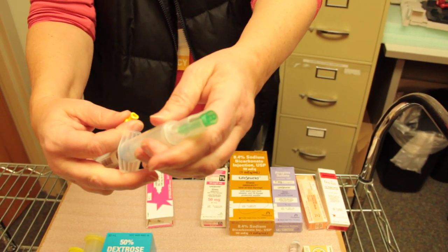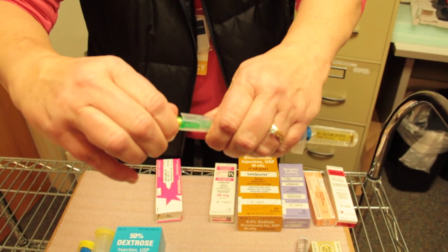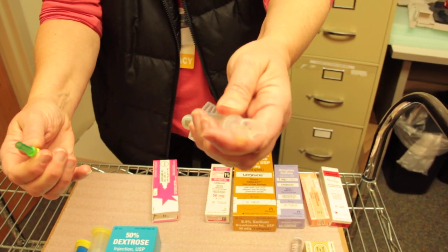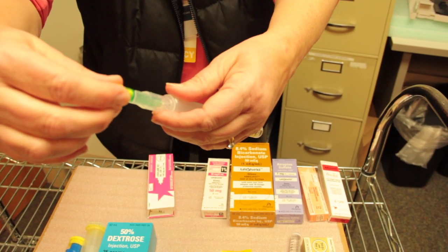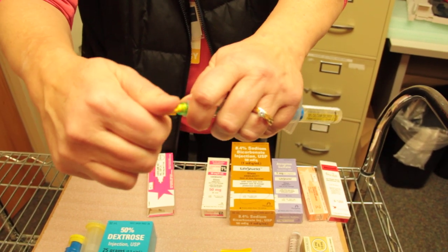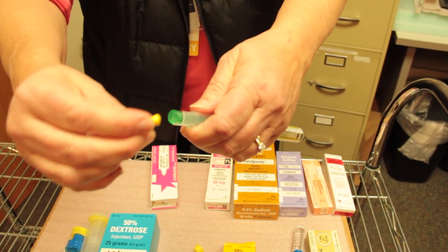What happens sometimes is people just pull that off and then there's no way to administer that to the patient. You have to be careful — there's a needle in there — just put that green piece back on and gently detach the yellow cap.